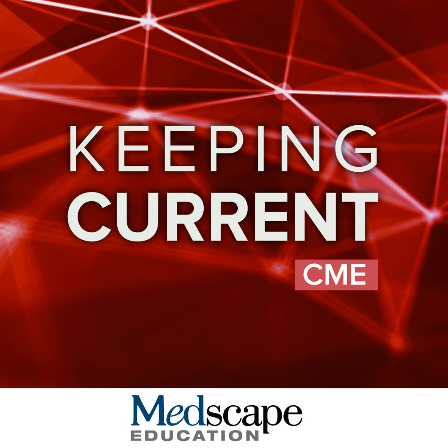And again, CT is a great modality to screen for traumatic injuries of the brain, but also of the rest of the body. So in the acute phase, CT is the imaging modality most often used. CT can detect acute traumatic brain injury that would require immediate neurosurgical care. And so that's another reason why CT is typically used in the acute phase.